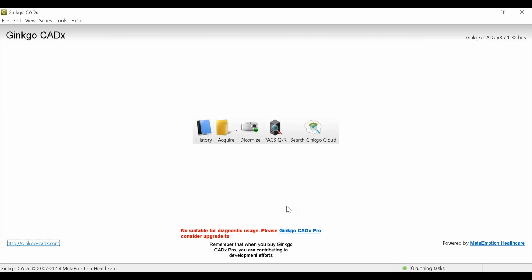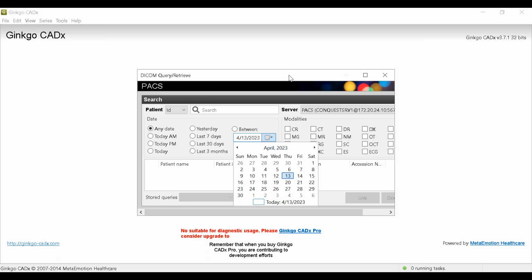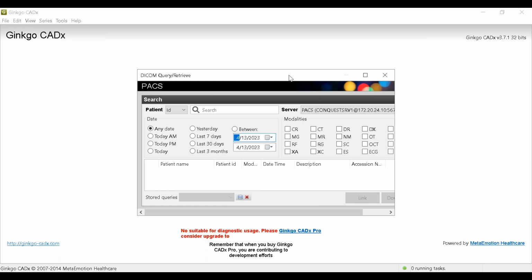I'm going to go ahead and apply and accept. We're going to do something called a query retrieve. Now, query retrieves are exactly what it sounds like. A lot of people call it a DICOM move.